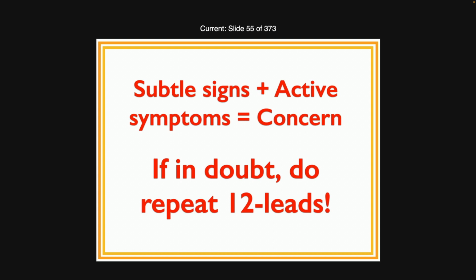Are there any questions about that before we go? If you're seeing early ischemia, is that like a cardiac alert? Oh, okay, good question. What do you do? Well, I'll throw it back at you all. What do you think you do? Let's say you have a 12-lead where you see these hyperacute T waves, but not enough ST elevation, not two or more contiguous leads, but the hyperacute T waves are in a particular area. What would you do? And the patient's signs and symptoms are consistent with ACS.